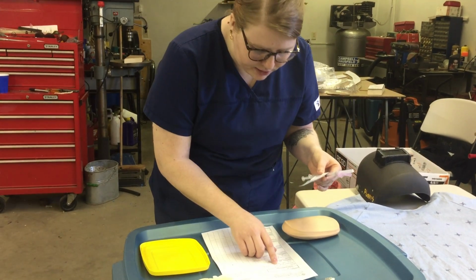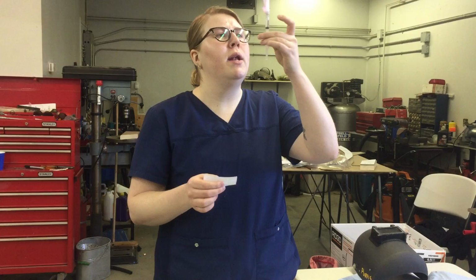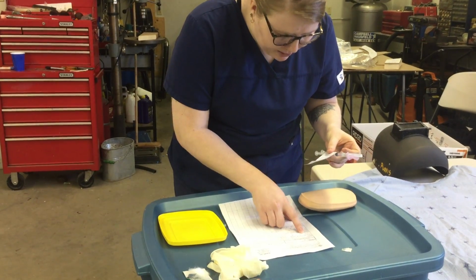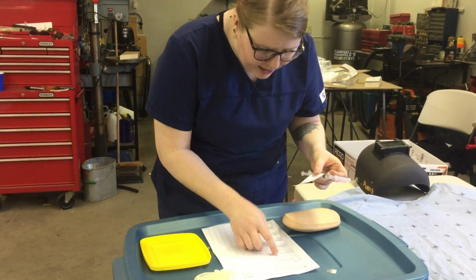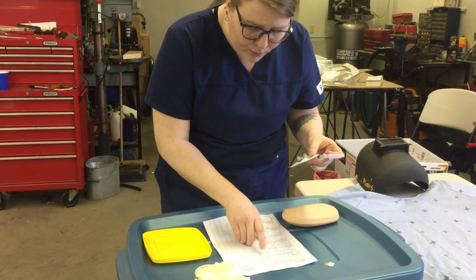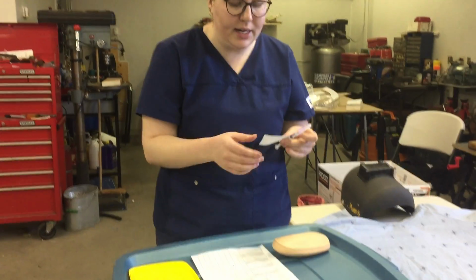So we have metoclopramide. This is metoclopramide in my syringe. We have 5 milligrams. So it's 5 milligrams per ml. This is 1 ml with no bubbles. So that is correct. We have subcutaneous, this is the correct subcutaneous needle, so that is good. We have daily, it's written here at 0800 once, so it's 0825. It is 0825 on the 7th, it's to be given at 0800. We are within that time frame, so I can go ahead and give this drug now.